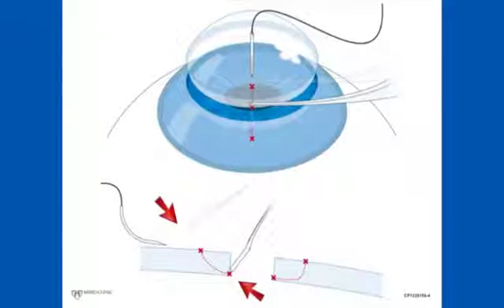Next, we ensure that the two tips are angled at an approximately 45 degree angle relative to the surface of the cornea. Next, we walk the inferior tip down the edge of the graft until we are just above the deep margin. The resident can judge the depth of the tip once they learn how to look through the cornea from the surface and note how the resolution of the tip blurs as it moves deeper down the graft edge.